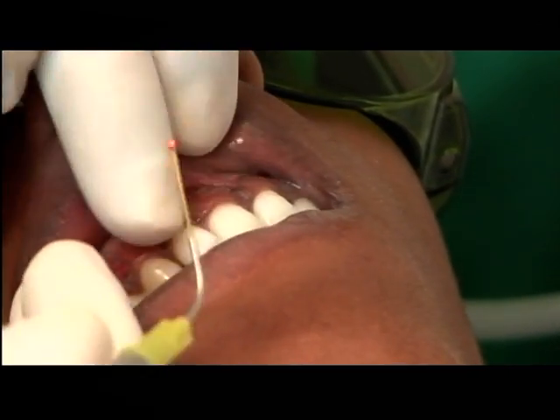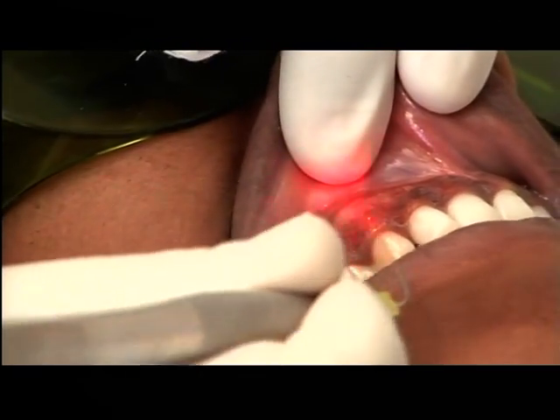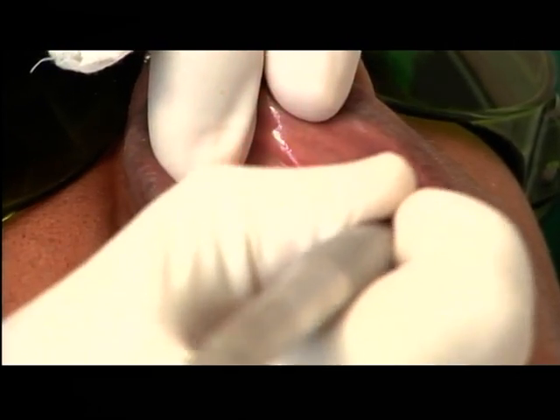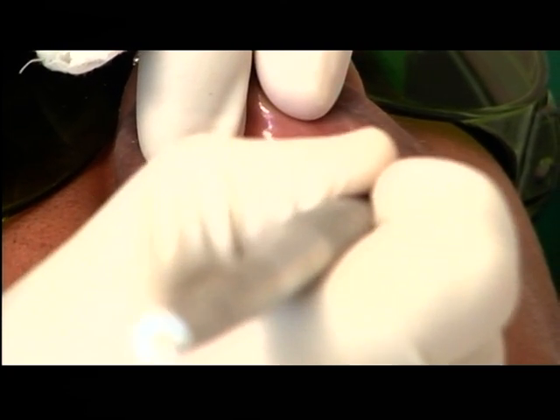We are doing the interdental papilla also — I have done it between the central and lateral as well. The only thing you have to be careful about is you are not going to touch the tooth.